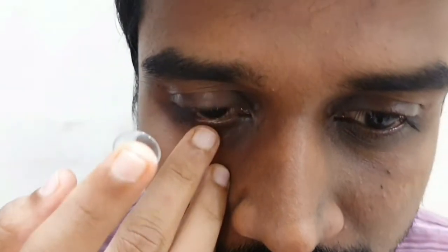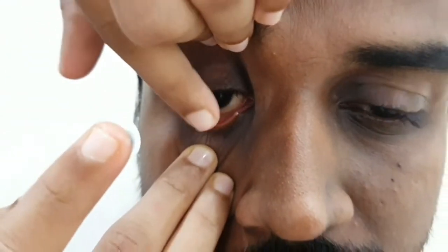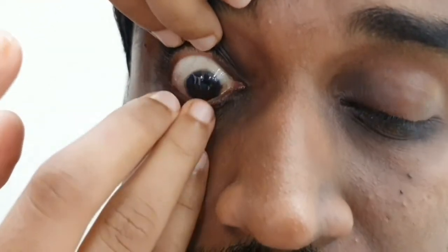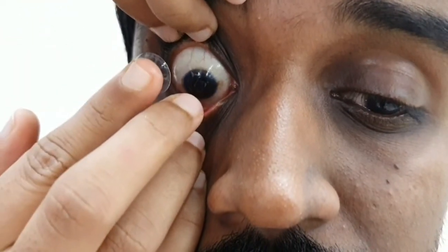For inserting the contact lens, use your right hand middle finger to pull the lower eyelid, and use your left hand index finger to pull the upper eyelid with the lashes to prevent over-movement of the eye. Then look up.